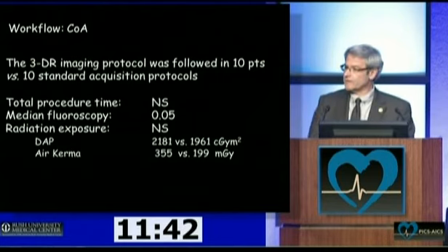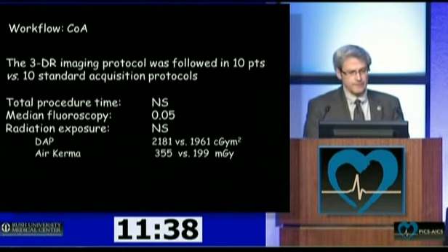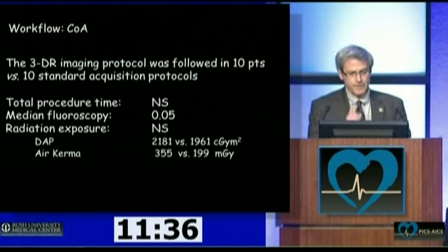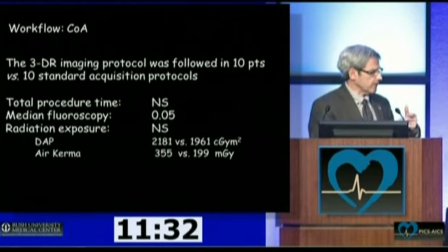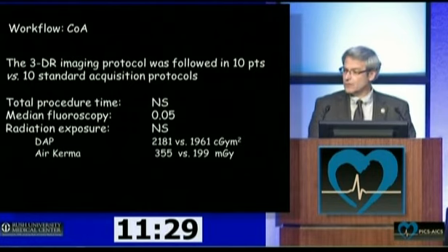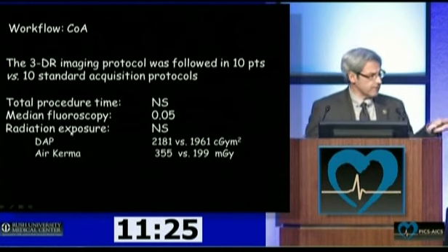So we've done a little comparison study, not very scientific, mind you, because it wasn't done prospectively, but nonetheless, we compared 10 patients that we acquired the procedure with the Dyna CT and 10 without. The procedure times were the same, so it didn't lengthen it.